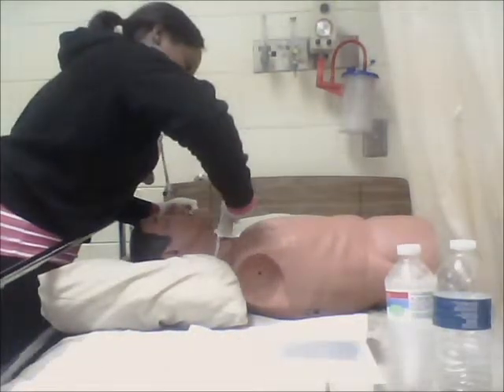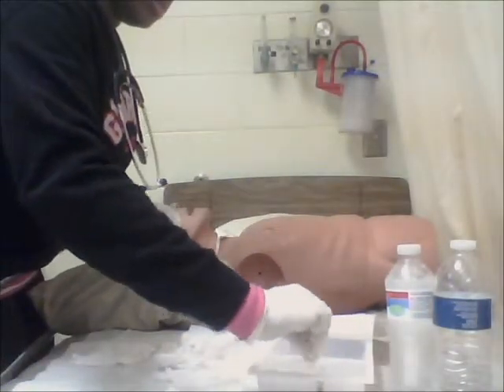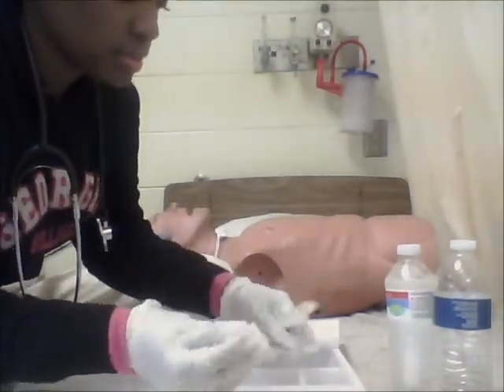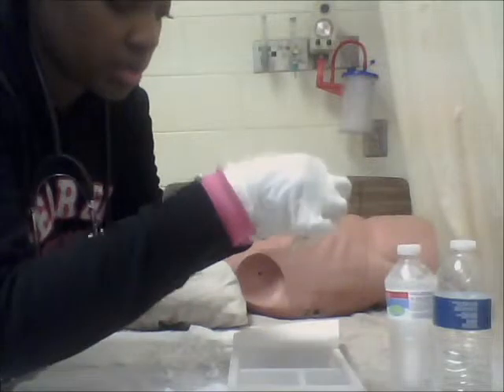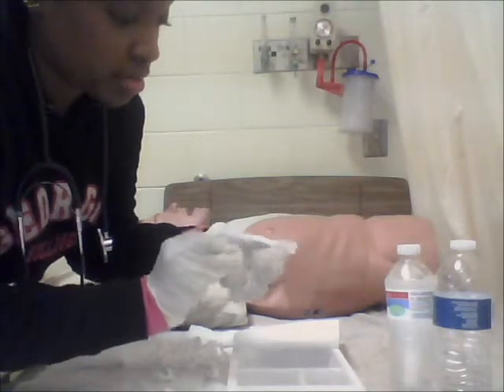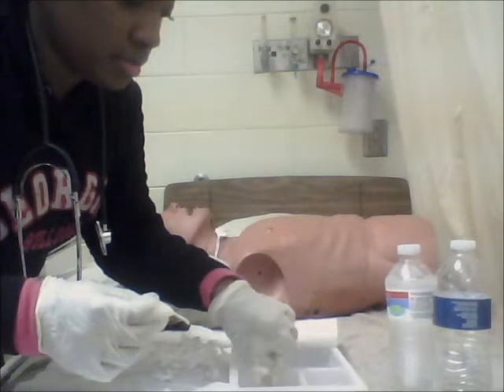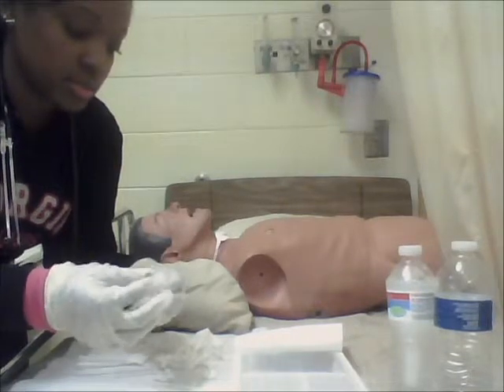Now I can remove the inner cannula. And I'm going to dip it in the hydrogen peroxide sterile water mix. And now I'm going to clean the inner cannula with the brush, making sure that I go through to get anything out of the inner cannula. I'm going to brush the outside. And now I'm going to take the pipe cleaner, clean the inside of the inner cannula with the pipe cleaner.